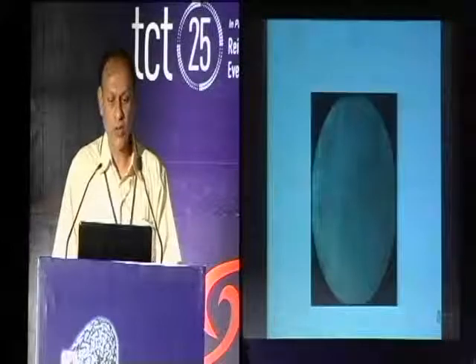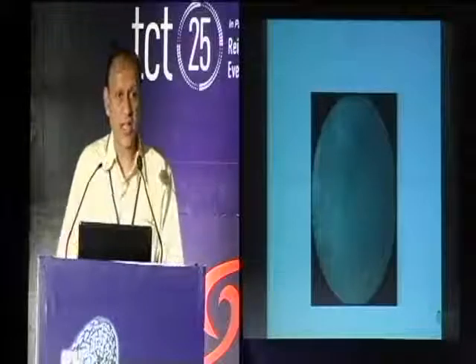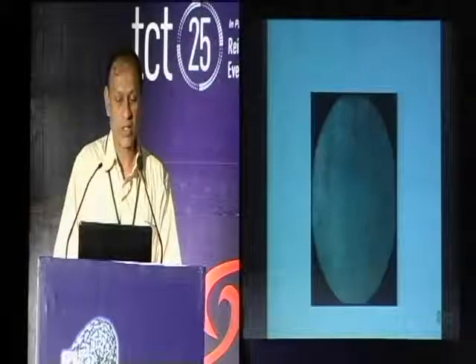A very tortuous aorta, you need to sometimes put in a very long sheath to engage the right coronary artery with the standard guiding catheters. This is one example wherein the guiding catheter is sitting in the sinus and we try to wire the lesion sitting in the sinus. The procedure was completed successfully with the catheter.